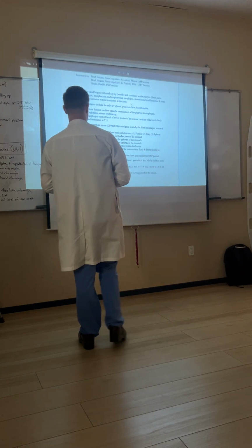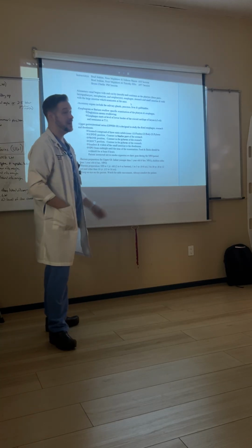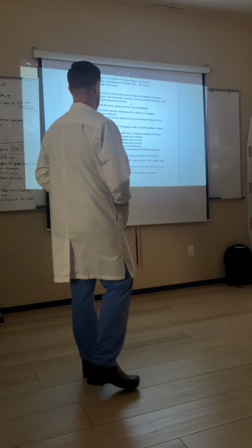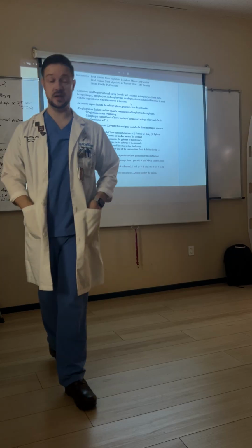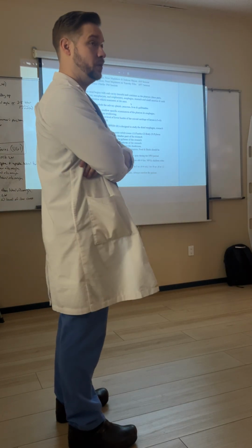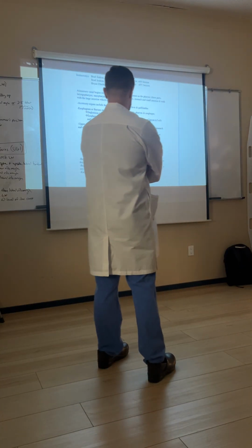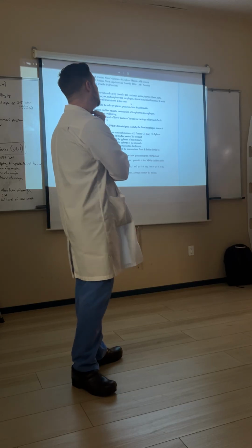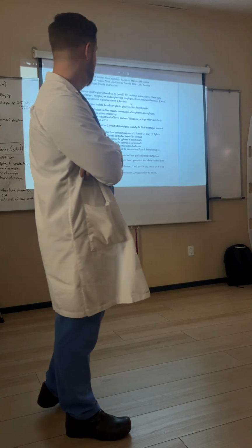The exam that we use to interrogate the esophagus is called the esophagram, aka the barium swallow. Okay? It's a specific examination of the pharynx and the esophagus. For your notes, because it may come up again, especially on your exam on Friday, deglutition is the medical word that means swallowing. Also for your notes, the esophagus starts at the level of the lower border of the cricoid cartilage, right about here, of the larynx, and it terminates at T11.